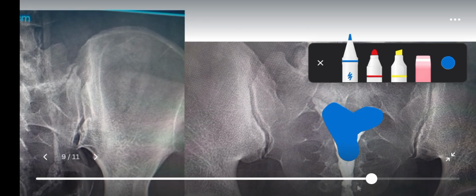We see another case here. This is a womb. Then we see the end here. It did not continue to show us the tube, so it closes at that end. Now, whenever the tubes are closed, it could be a case of spasm where the tube on its own closes because of the discomfort of injection of the contrast and pain being felt by the patient. That is a false closure of the tube. It doesn't mean that the tube is closed.